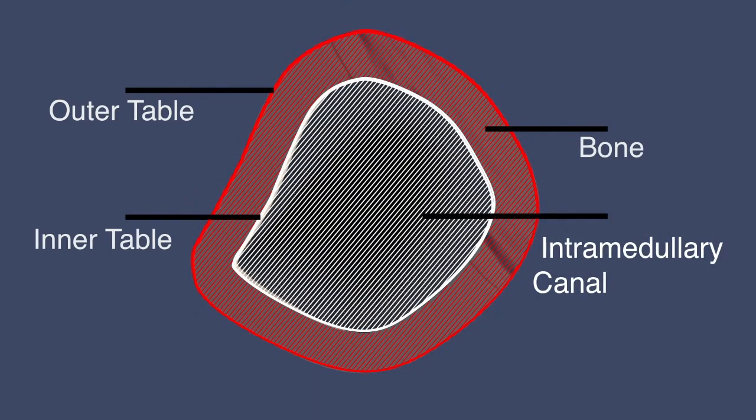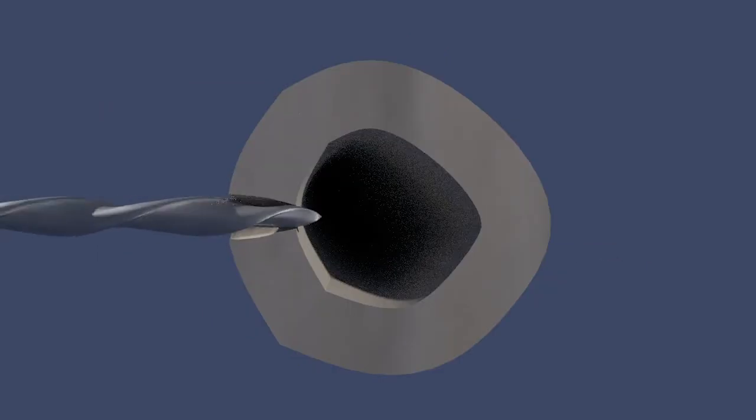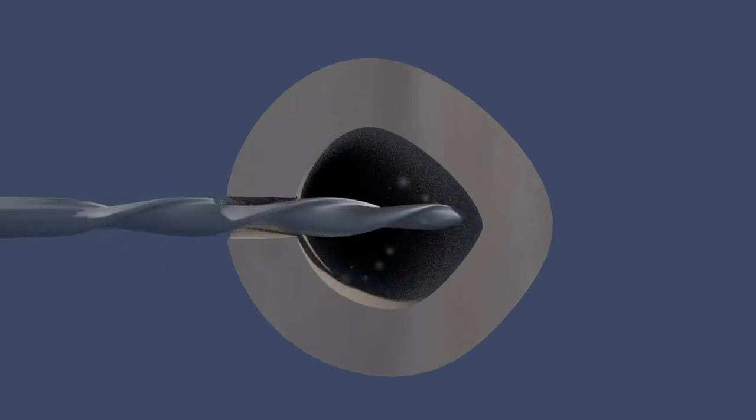As the drill enters the canal, there is less resistance to the forward movement of the drill, and the tactile feedback and sound of the drill will actually change. This is important to note, as an advanced skill of drilling is to stop drilling at this point, since you are about to clear the cortex of the bone, and this will help you to avoid plunging. Plunging is when the drill goes far past the layer that you're supposed to drill.